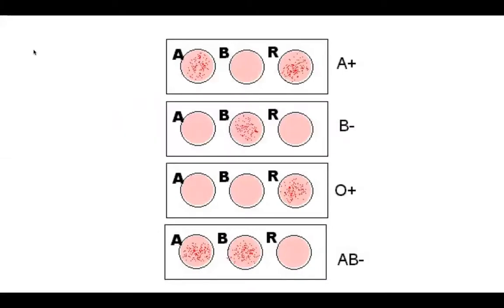Now in lab today, you're going to use these little dishes. I'll show you in 1 second. And if they clot up inside these little dishes, we say that they have the antigen against that particular blood cell. So if I'm trying to test somebody's blood, if it gathers up like so and clots, this would be blood type A. Inside that tube was a little bit of the antibodies. And when I put the blood in there, it clots up, which means he has blood type A. Now it also clotted here at the Rh factor, which means he's A positive.